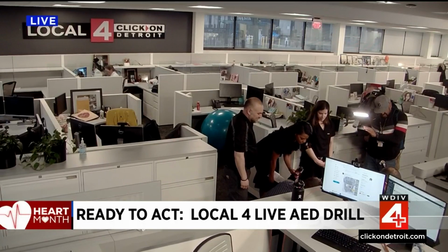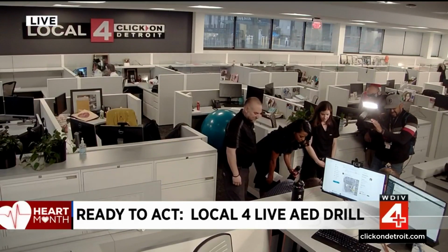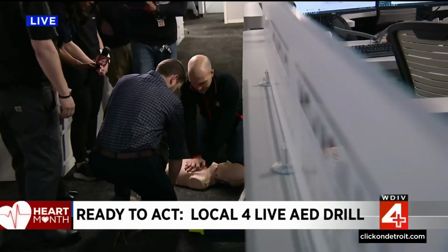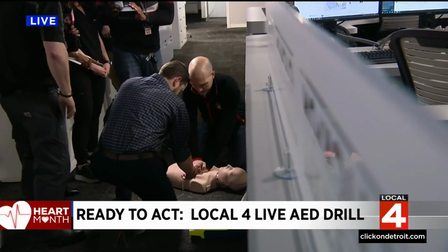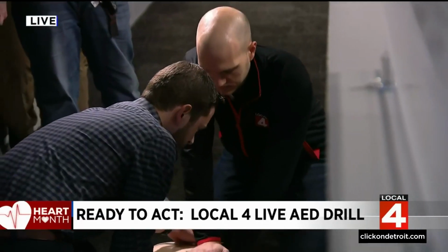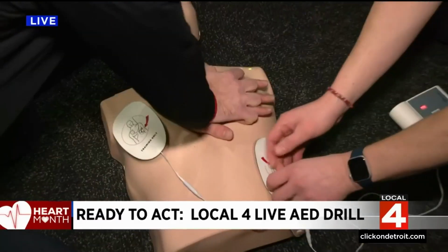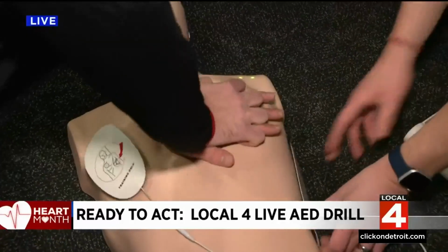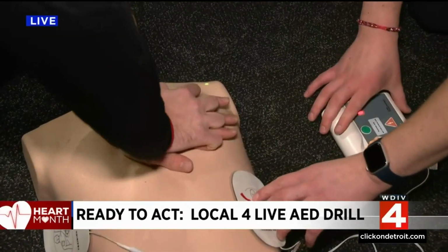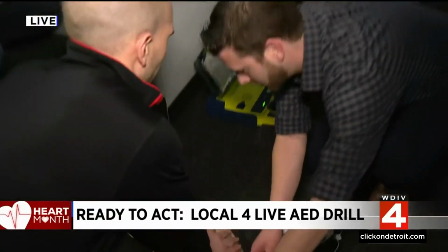Remove square foil package from lid of AED. Tear open foil package, cross dotted line, and remove pads. So should you continue the CPR constantly? Hands-only CPR. So yes, it's fine. You definitely continue that constantly because right now he is acting as the heart for the body. So what we're trying to do is analyze the rhythm.